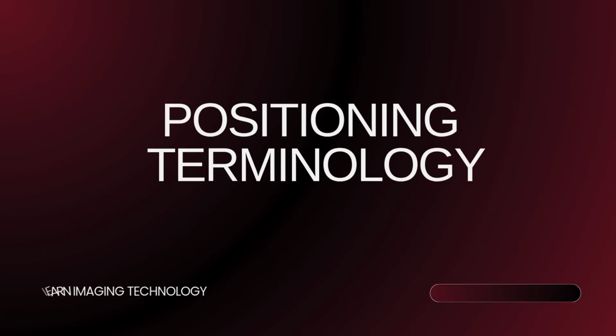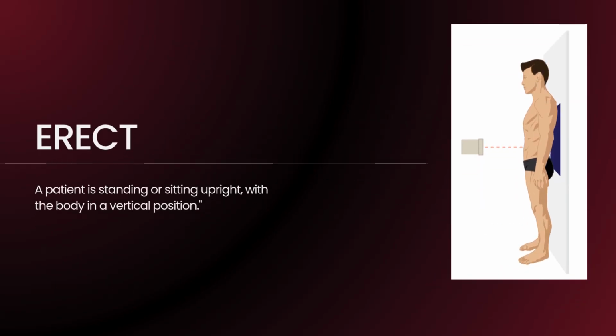The first thing we'll be looking at is erect. When you talk about your patient is erect, that is, the patient is standing upright. And this time around, I want you to understand that it is both standing and sitting upright. That's what we term as erect, with their body in a vertical position.